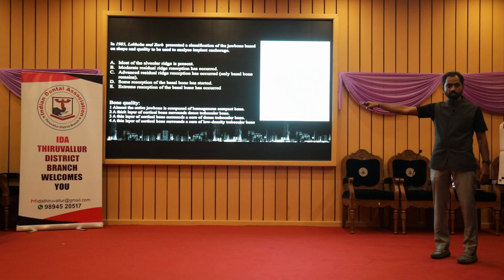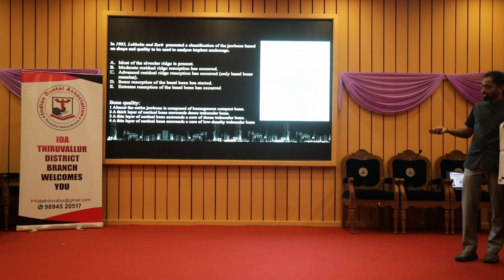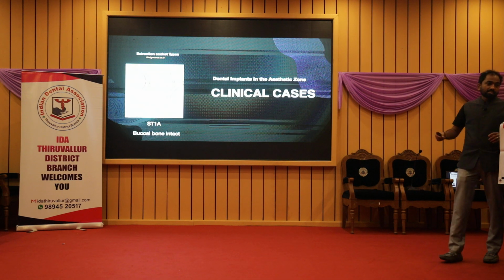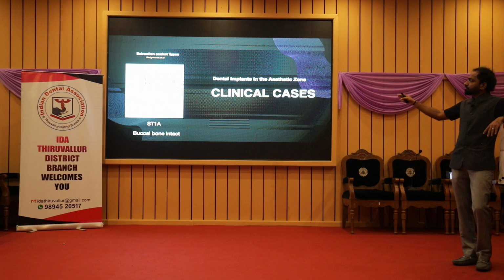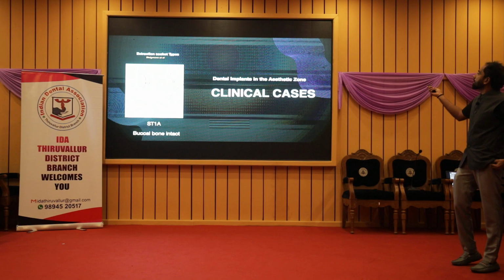Okay, and the bone quality, you know that D1, D2, D3, that is the Carl Misch classification, that is more than enough. Okay, now that's the theory part. I just rushed in because, let me show some cases which I have done. I think it is cases only.